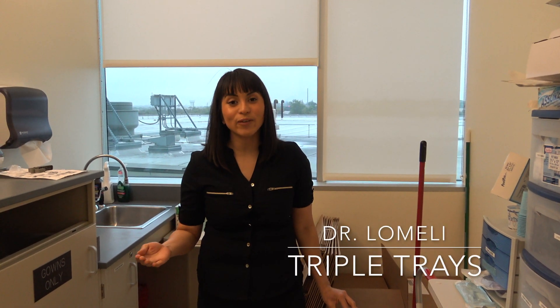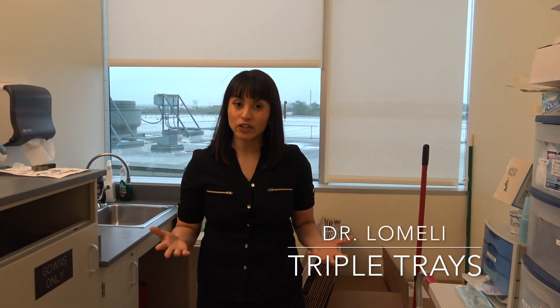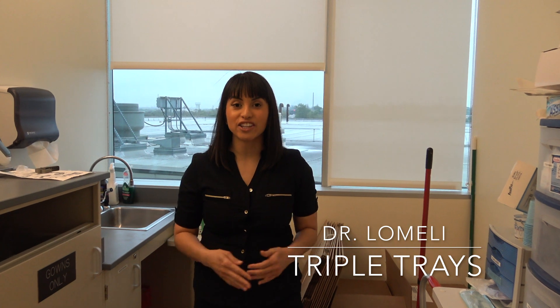Hi, I'm Dr. Lomeli and today we're here to demonstrate how to pour up a triple tray impression.